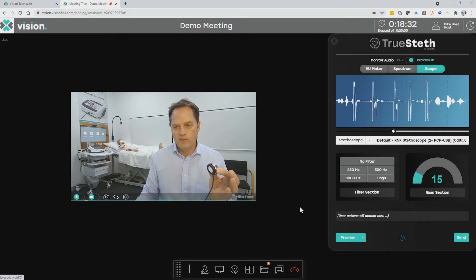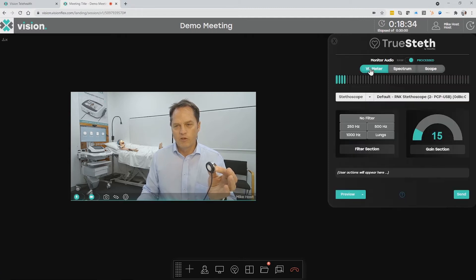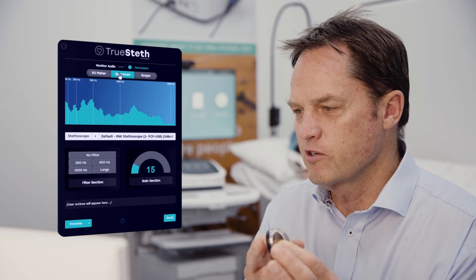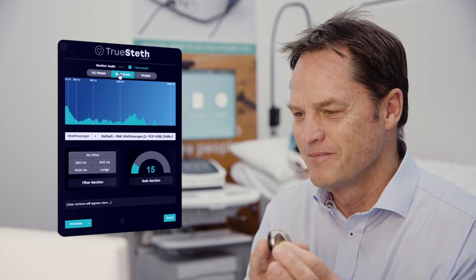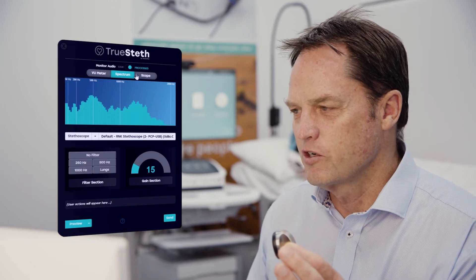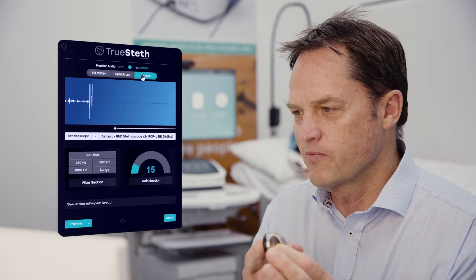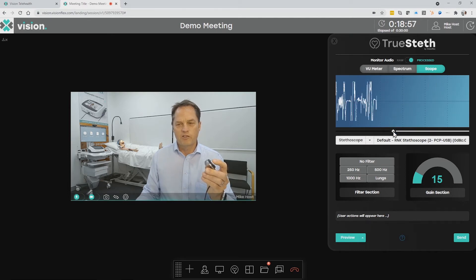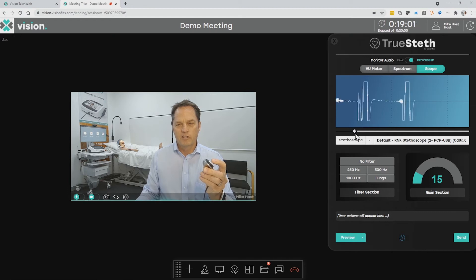I can show that trace as a volume unit meter so I can see the amplitude of the signal coming through the stethoscope. I can show it as a frequency spectrum to see the range of frequencies coming in, and I can also show it as an oscilloscope trace. By dragging the diamond under the blue trace to the left, I can change the time base and look at the waveform of the stethoscope.